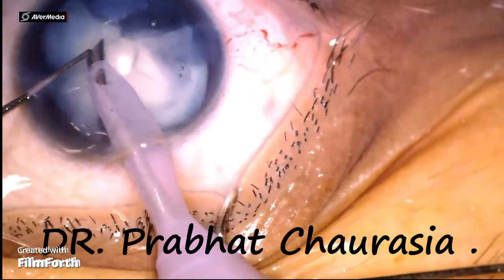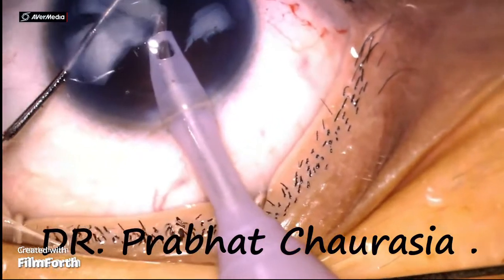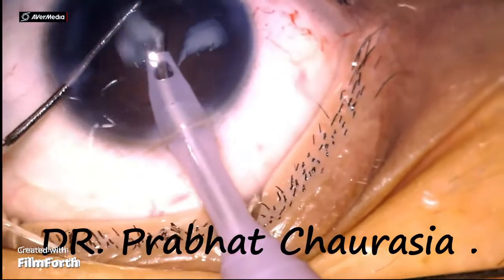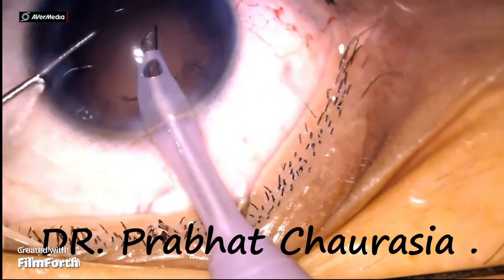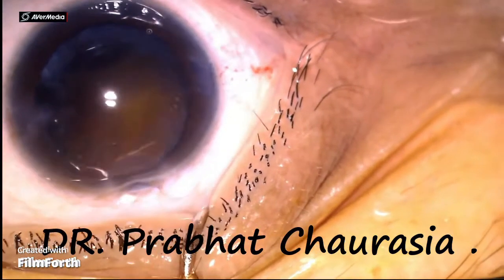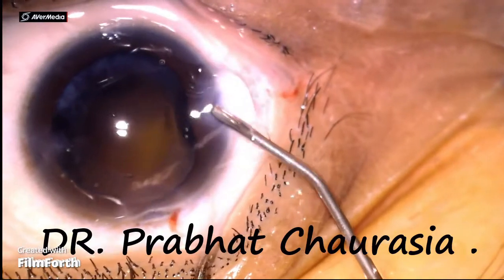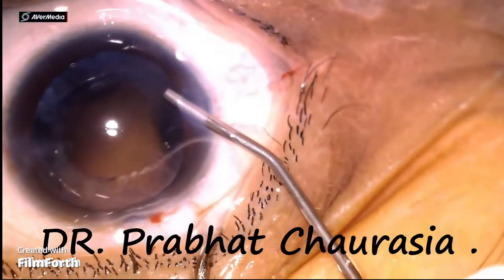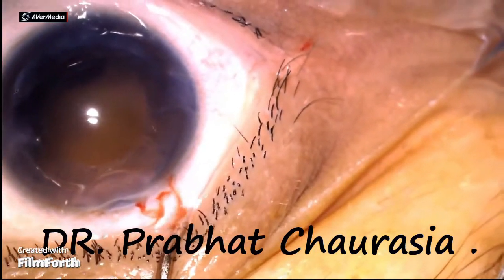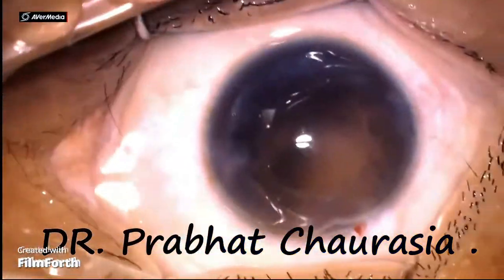Always be careful while emulsifying the last nuclear piece. After emulsifying every quadrant, take out the phaco needle and inject 2% HPMC. Clean the cortex with the help of either a Simcoe cannula, bi-manual irrigation aspiration cannula, or you can use a coaxial cannula.